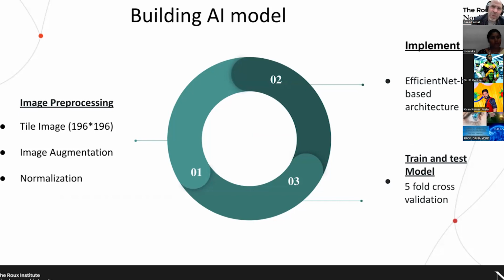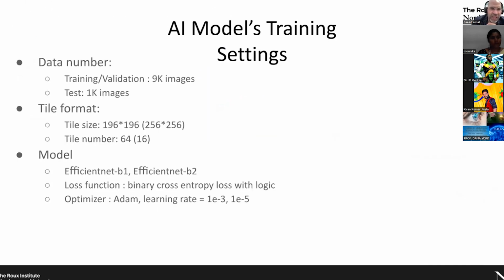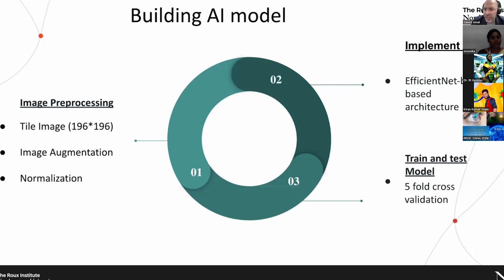We used a couple of different techniques. In that case, one of them is the EfficientNet, which is focused on high resolution images, given the architecture where we scale between the width of the convolutional nets and the depth of the number of layers. And it's efficient in terms of the features, so it's more efficient to train such a model. It helps also in generalizability given these reduced number of features.